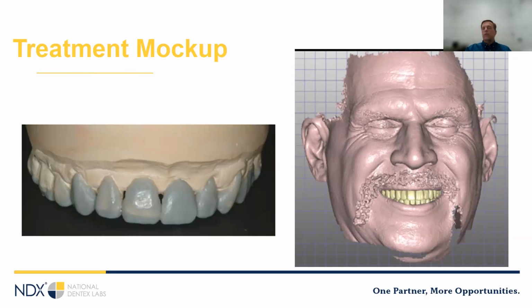Digitally, we either do a photo orientation Photoshop method of relating a proposed design to the patient's face, or 3D facial scanning to actually design the case oriented to the patient's face, like you see on the right here. Once this template is approved, this is what we're going to follow for the provisional and final restorations.